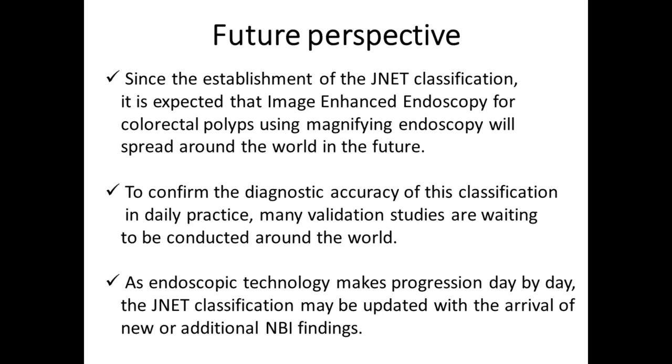Since the establishment of the JNET classification, it is expected that image-enhanced endoscopy for colorectal polyps using magnifying endoscopy will spread around the world in the future. To confirm the diagnostic accuracy of this classification in daily practice, many validation studies are waiting to be conducted around the world. As endoscopic technology makes progression day by day, the JNET classification may be updated with the arrival of new or additional NBI findings.